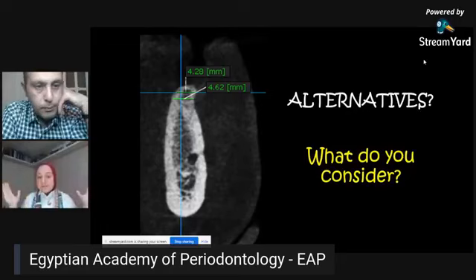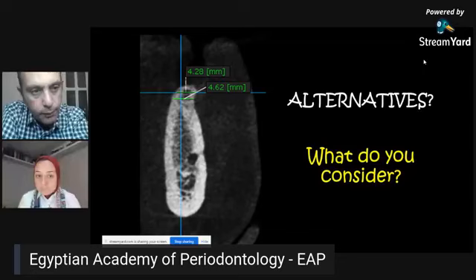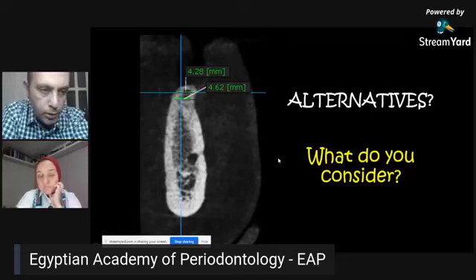I know that the cortical part is a little bit wide here, but according to them, it's pyramidal in shape. There is a lot of cancellous bone, so it's an ideal case for osteodensification. According to the technique, the doctor who made this technique, I mean. Yes, usually they recommend enough spongy bone.